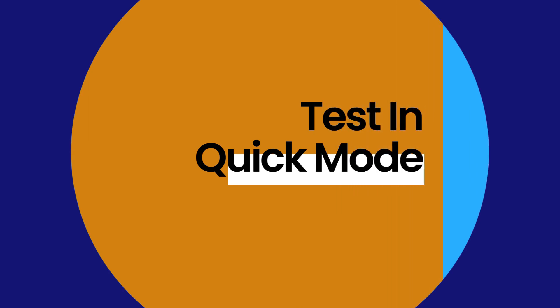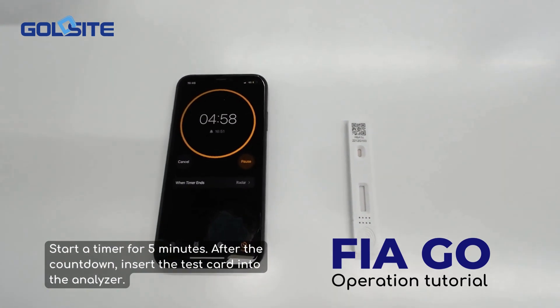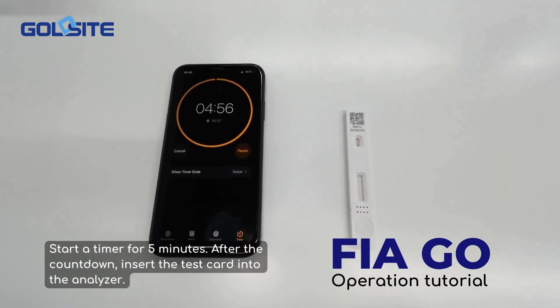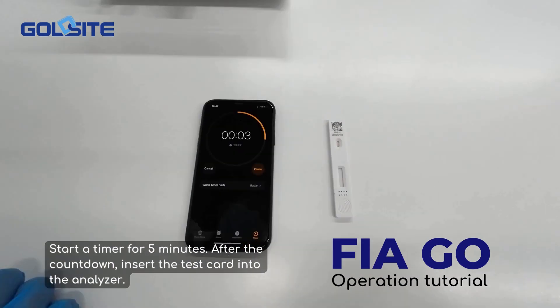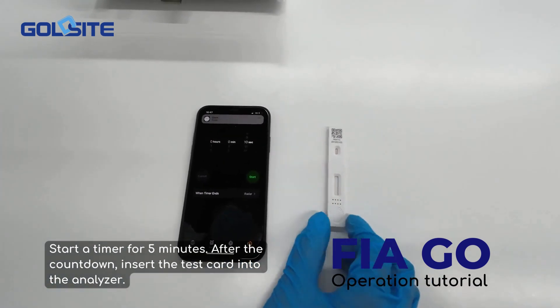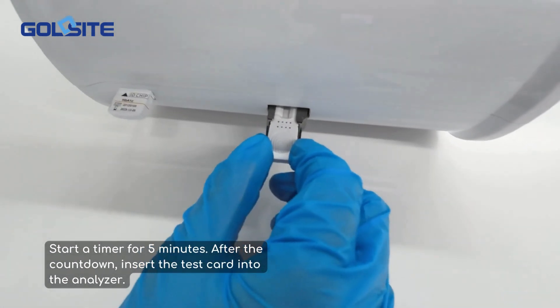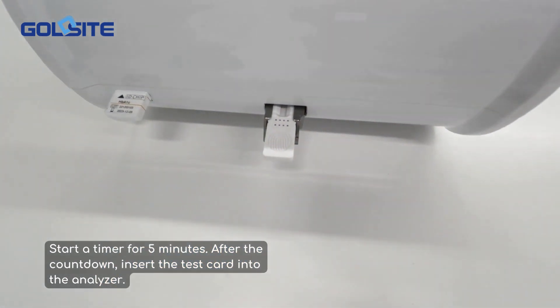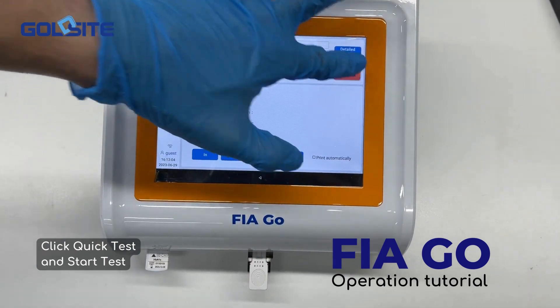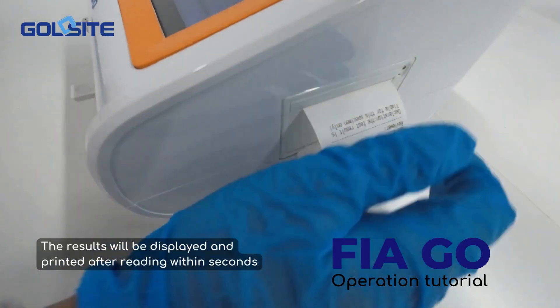Test in quick mode. Start a timer for 5 minutes. After the countdown, insert the test card into the analyzer. Click quick test and start test. The results will be displayed and printed after reading within seconds.